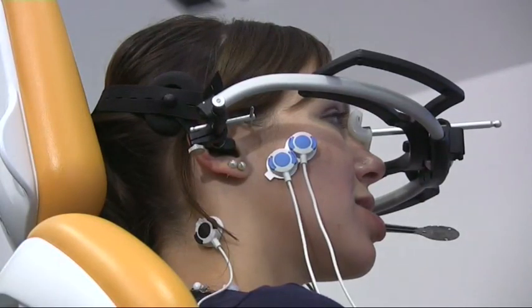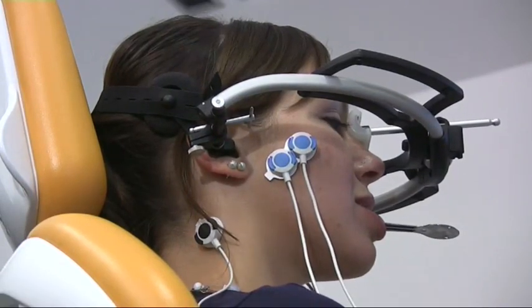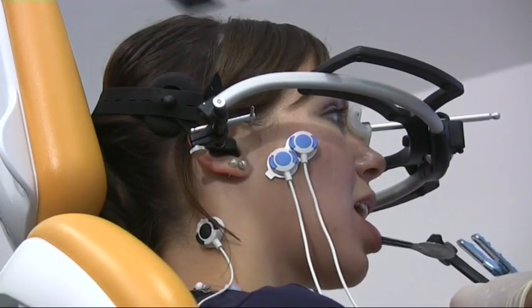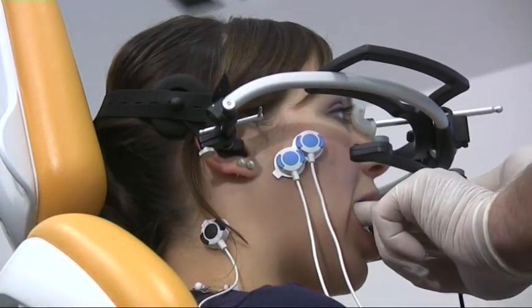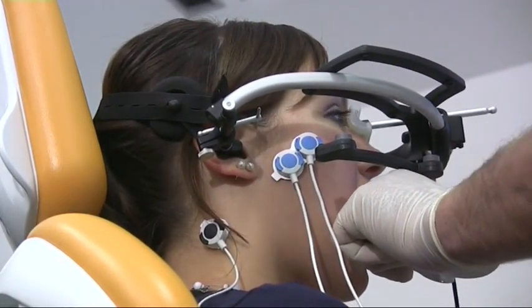Now we will make a recording of the Gothic arch with simultaneous control of the muscle activity. First we position the bite fork. Open please. Bite fork put into position. Sensory bow placed on the bite fork. Open please. Bite fork adjusted.